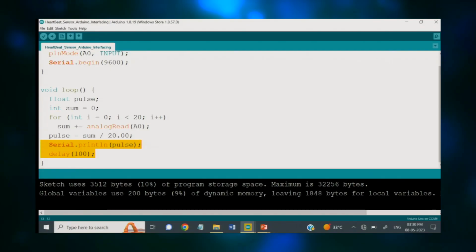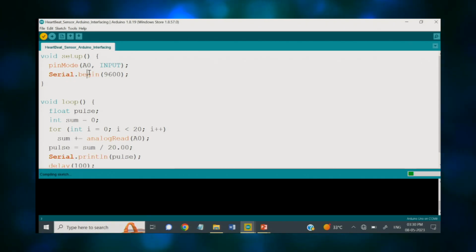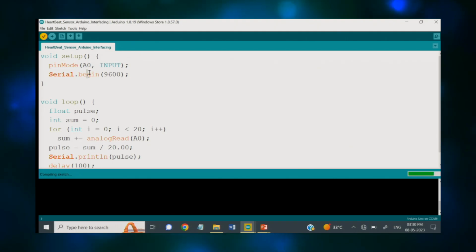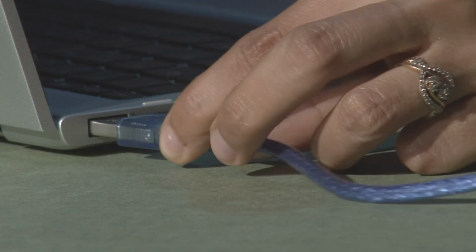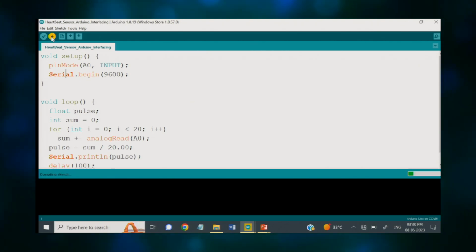So, this is your code and we can definitely compile it, and meanwhile we can connect our USB cable to your system for the further interface. So, let me just use this USB cable here, and our compiling process is also done, and we can now click on the upload button.